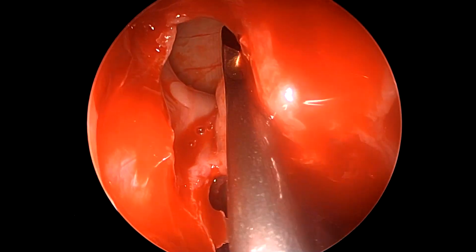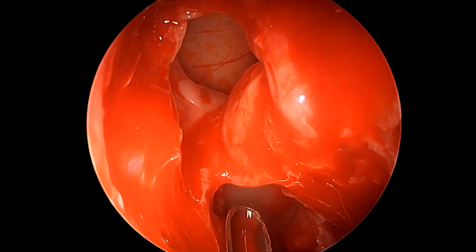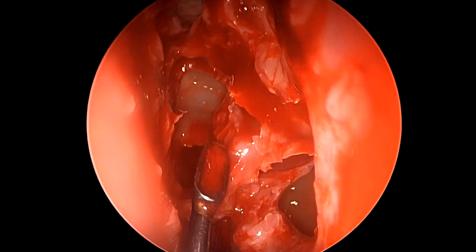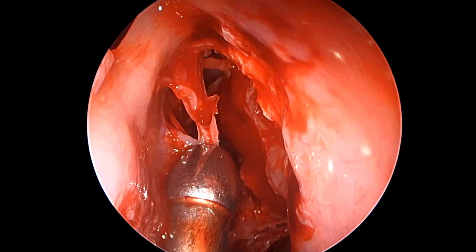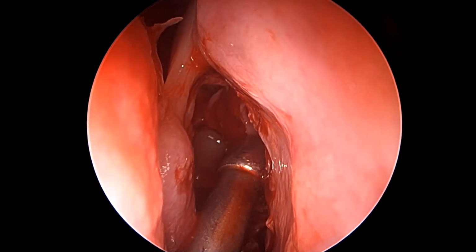And this, as you see, is that large suprabullar cell that we had identified, which was pneumatizing inside the frontal sinus, imitating an isolated frontal cell, which in actual reality are very, very uncommon and rare.